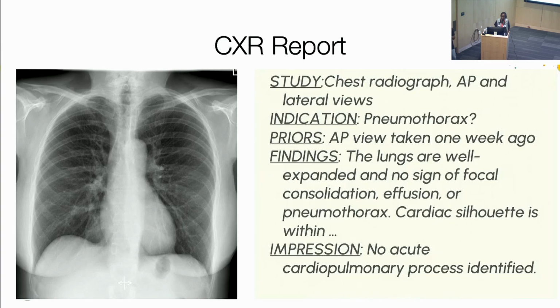So I think this is a really important nuance, not just for chest x-rays, but for any medical imaging: radiology reports come down largely to a radiologist's opinion about the case, right? We don't like to call it our opinion, but that's what it is, and it is imperfect. But the more descriptors you can glean from that, and now with LLMs you can do more than we used to be able to do, the better chance you have of getting the most accurate label for that image. You should just stand here so we can co-teach.